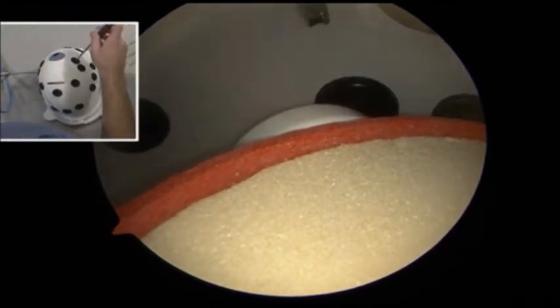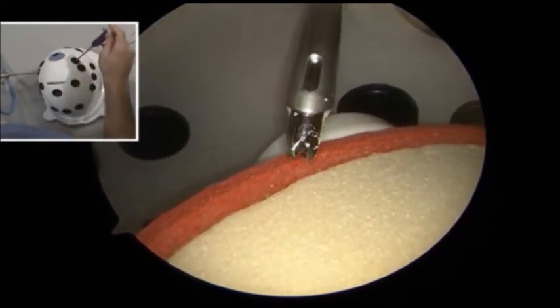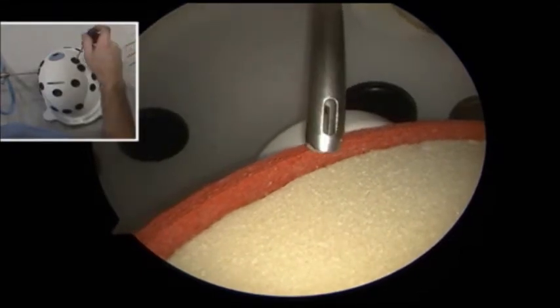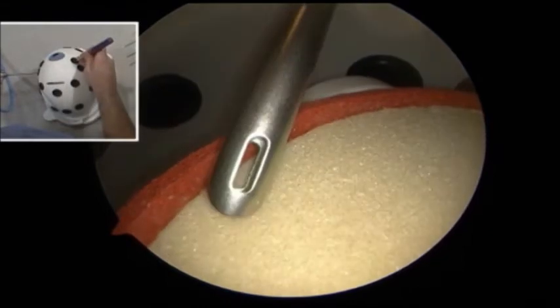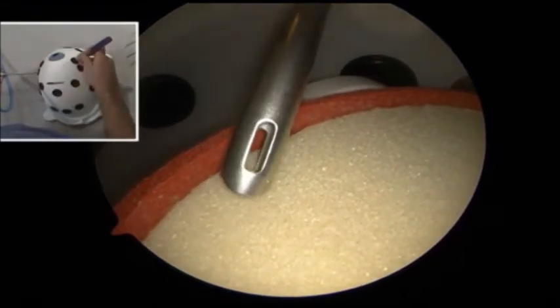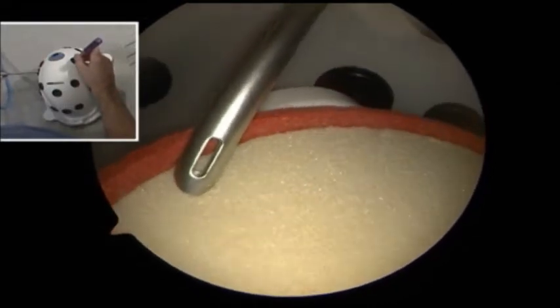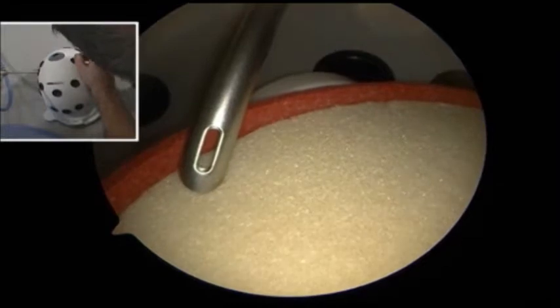We'll place our percutaneous drill guide. This does have an inserter on the inside that you can use to get through soft tissue. You can remove that, and then this goes on to the glenoid face. We're coming down here to the inferior margin, and again up on bone. And now I'm going to have an assistant drill the anchor.